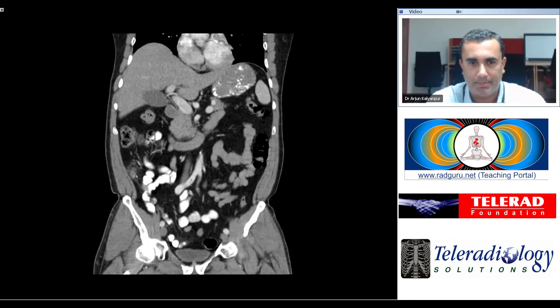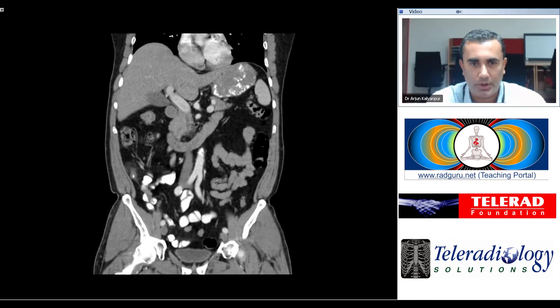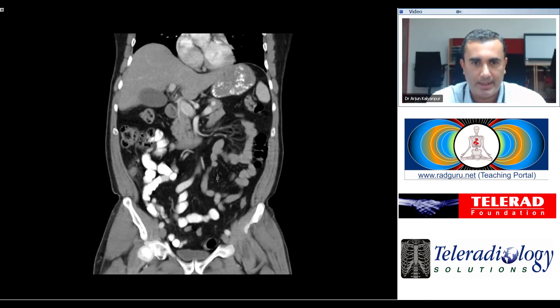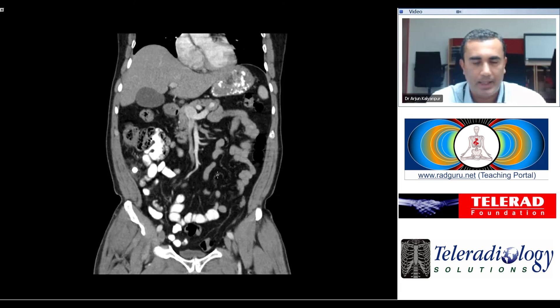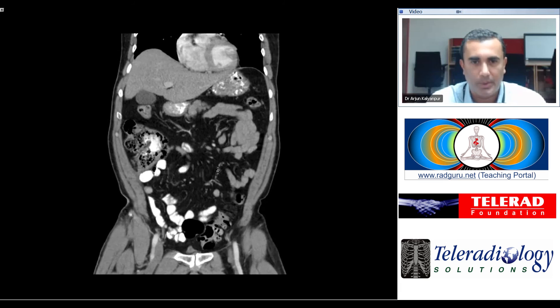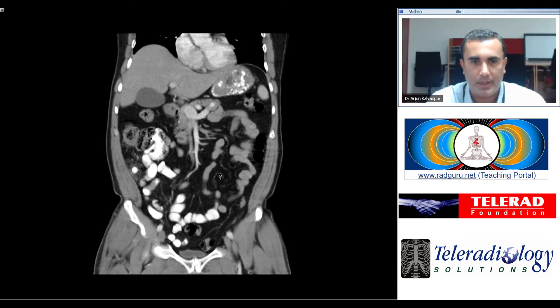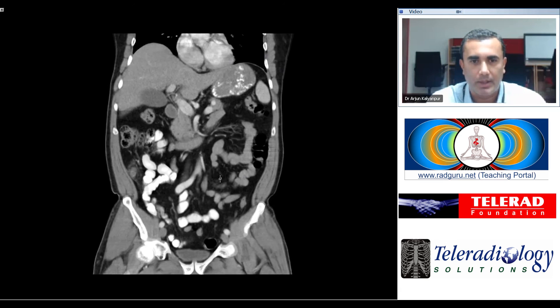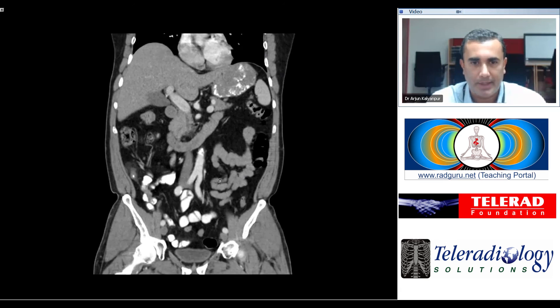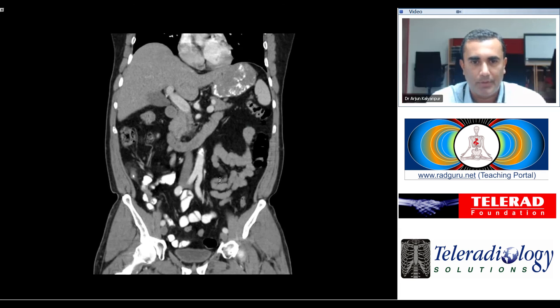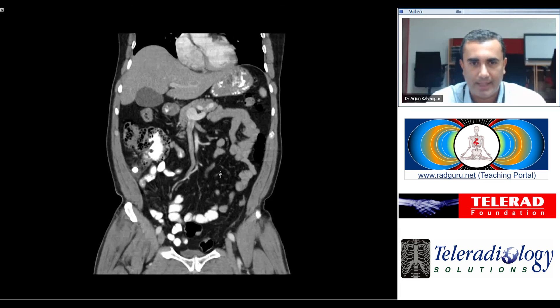The length of the appendix is extremely short, indicating that it is merely a stump, and this corroborates the history that the patient has already undergone an appendectomy. This is the example of stump appendicitis on CT.